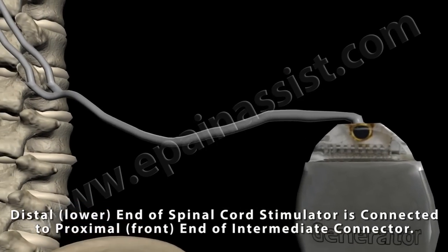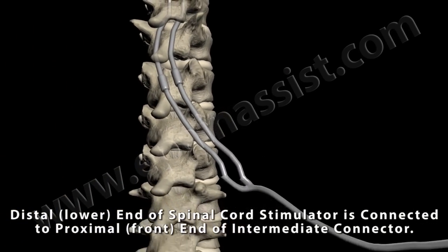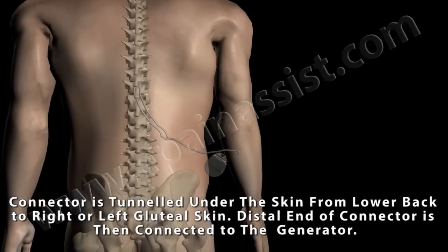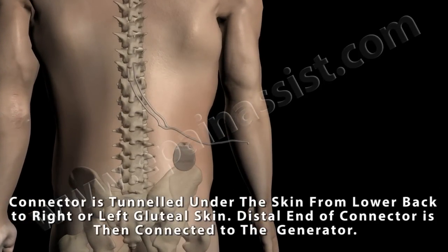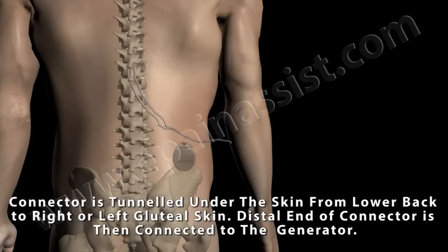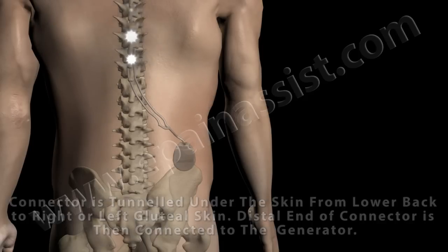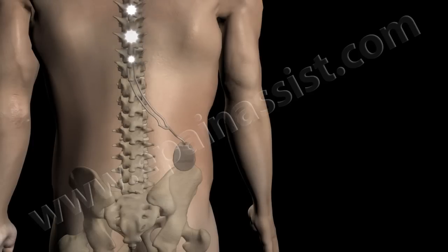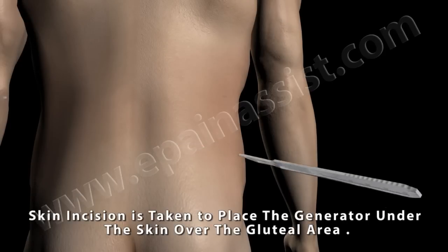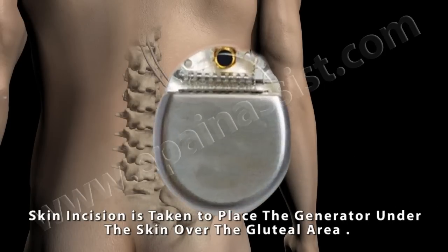The distal lower end of the spinal cord stimulator is connected to the proximal front end of the intermediate connector. The connector is tunneled under the skin from the lower back to the right or left gluteal skin. The distal end of the connector is then connected to the generator. A skin incision is made to place the generator under the skin over the gluteal area.